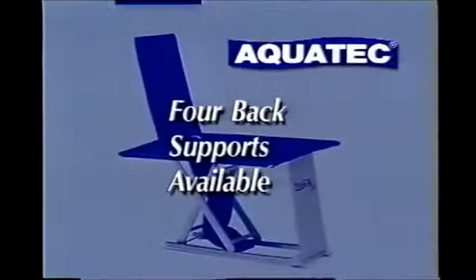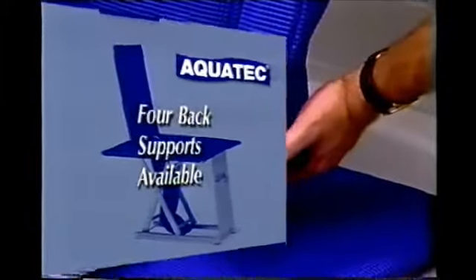Four back supports are available. The straight back support is standard on the Minor or Minor Two. It is simply placed in one of two positions on the seat, allowing for seat length adjustment.